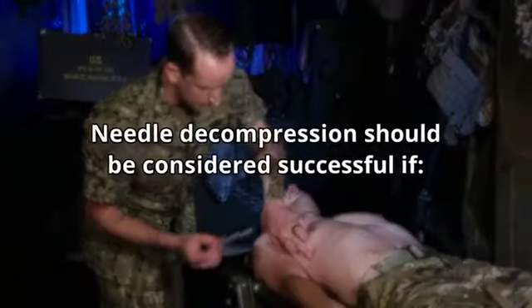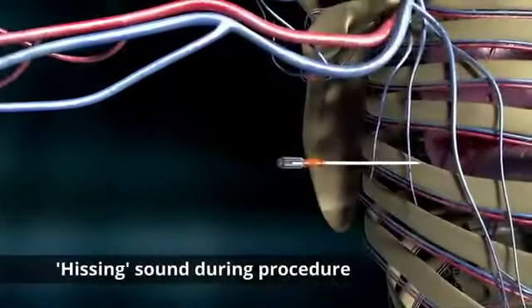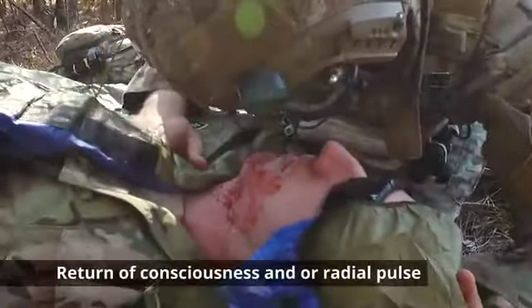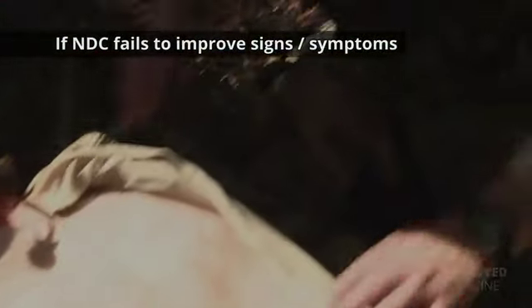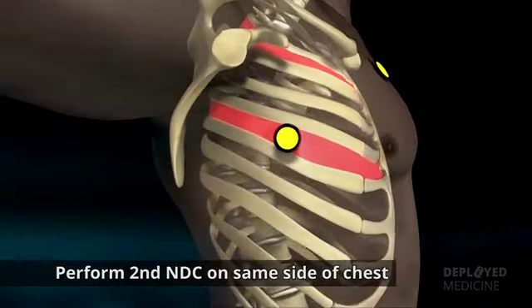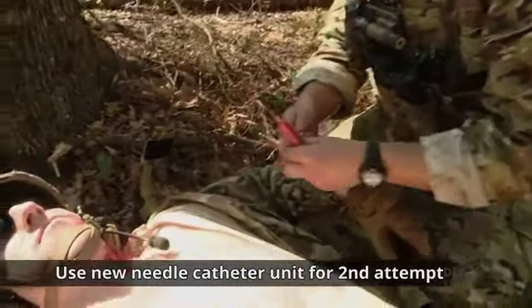The NDC should be considered successful if respiratory distress improves or there is an obvious hissing sound as air escapes from the chest when NDC is performed. This may be difficult to appreciate in high noise environments, or a casualty with no vital signs has returned to consciousness and/or radial pulse. If the initial NDC fails to improve the casualty's signs or symptoms from the suspected tension pneumothorax, perform a 2nd NDC on the same side of the chest at whichever of the 2 recommended sites was not previously used. Use a new needle catheter unit for the 2nd attempt.